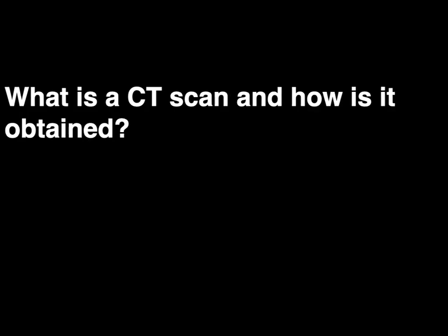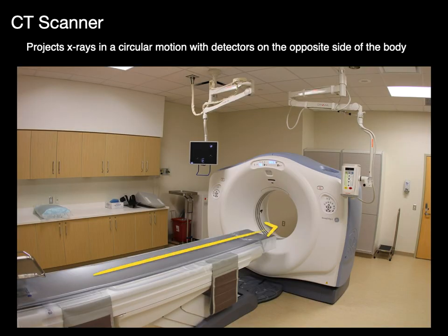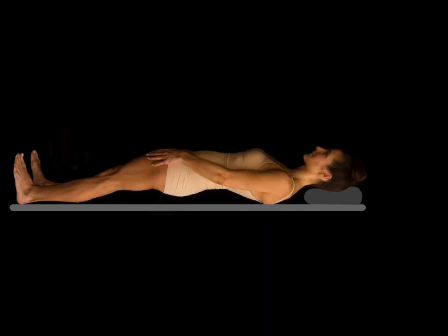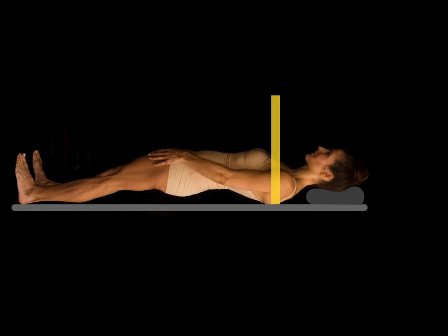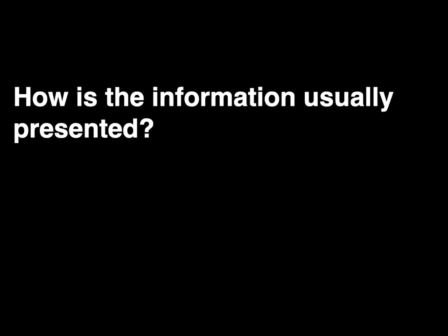So, what's a CT scan and how's it obtained? A CT scanner projects x-rays in a circular motion with detectors on the opposite side of the body. A patient lies on his or her back, and the table moves them headfirst through that circle where the x-rays project, and detectors pick up the x-rays after they go through the body. That yellow line represents that beam of x-rays, and those x-rays are received on the other side after they have gone through the body.